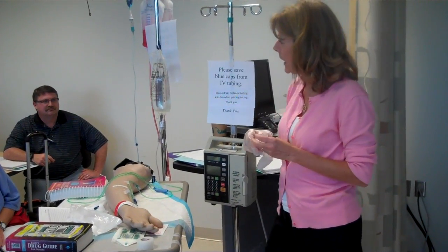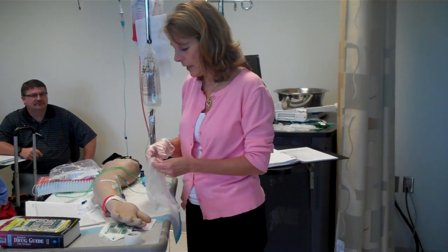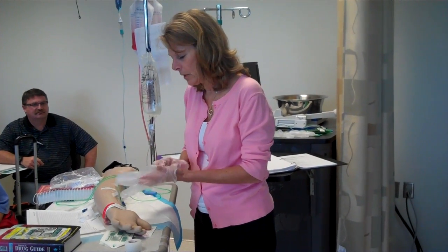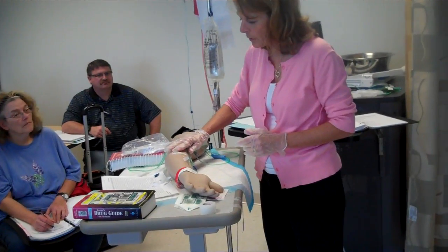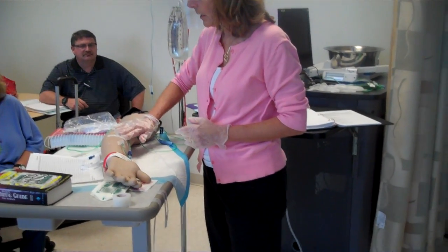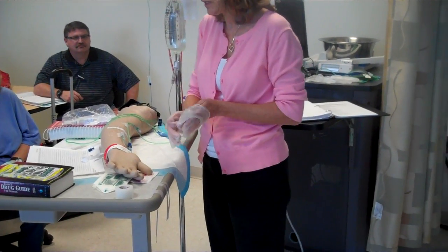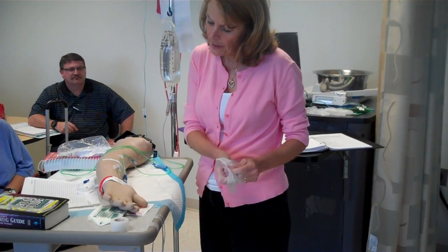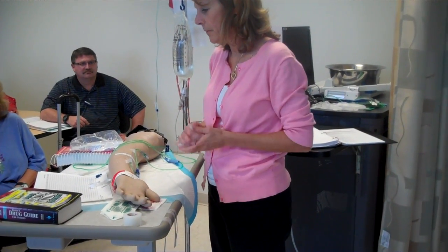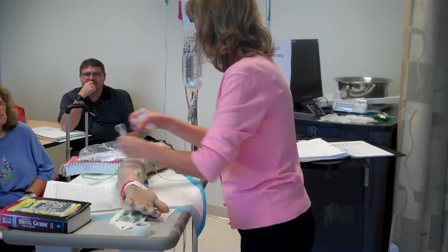Mr. Jones, I'm ready to hang this antibiotic, but I want to make sure you don't have any tenderness at that IV site. It looks fine, but just let me know if there's any tenderness here, okay? I'm going to palpate around that IV site. Does that hurt you? He says no. Alright, that's great. Look at his ID band. It's John Jones. Tell me your date of birth. 10/13/51. That is accurate.